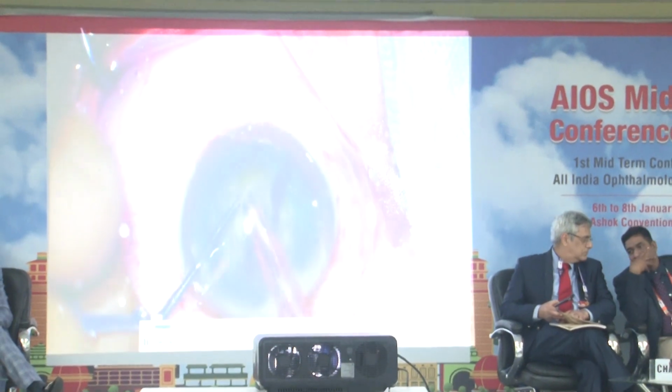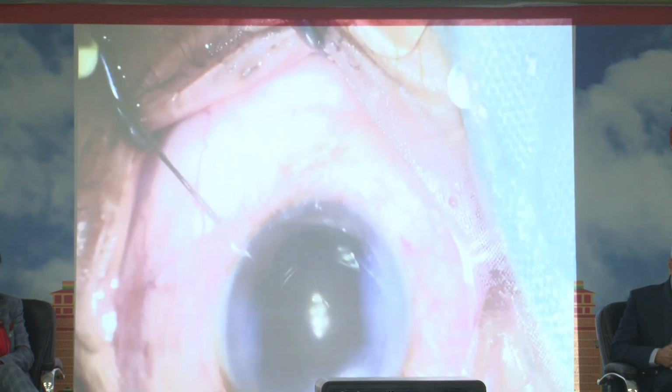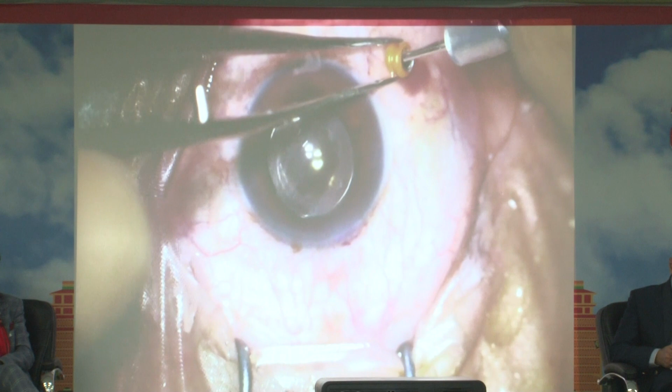Okay, so we do an injection, anti-VEGF injection, first before going for a vitrectomy. Especially hardest are the patients with combined retinal detachment. So this one's one of the fairly simple cases. He had a cataract also. So we went for a cataract surgery along with the anti-VEGF injection in the first sitting. And we do the injection 3 to 5 days prior to a surgery. So after 1 week, we went for a 4-port vitrectomy.